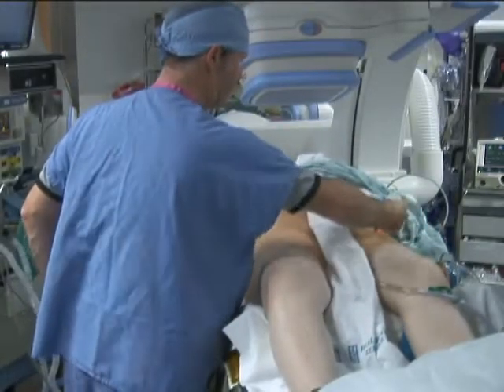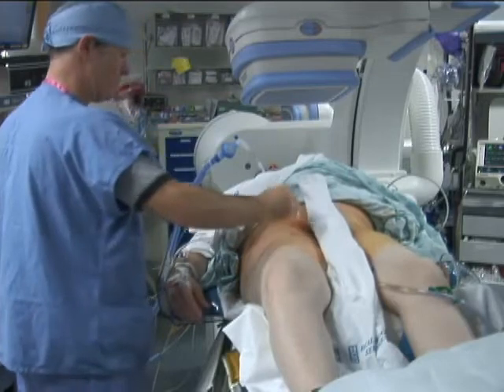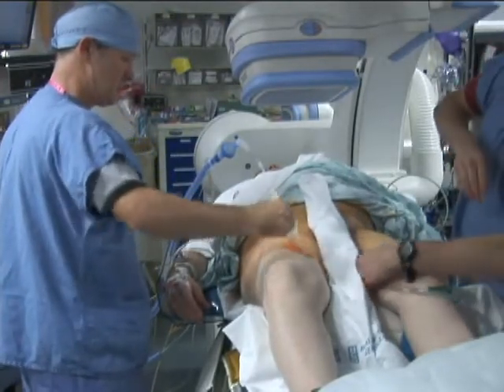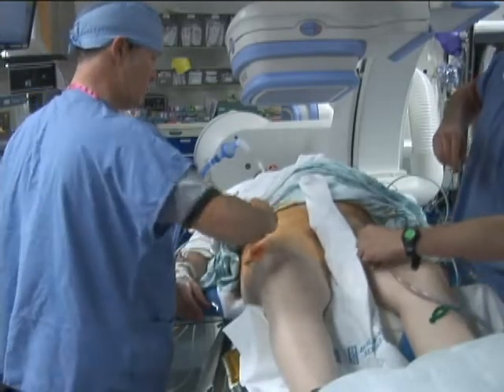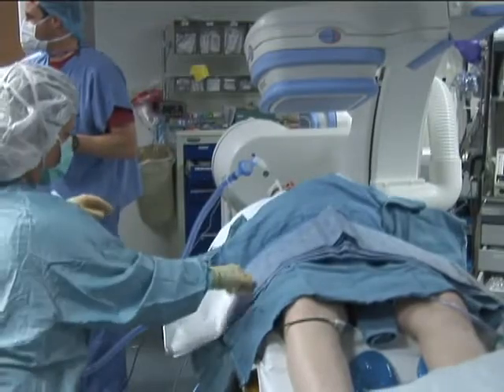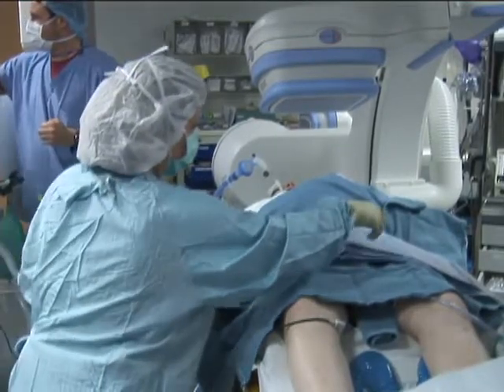Here we are entering only from the femoral veins, so the bilateral groins are prepped, though some operators may choose to access the internal jugular or subclavian veins as well. After prepping the areas for venous access, sterile draping is applied.